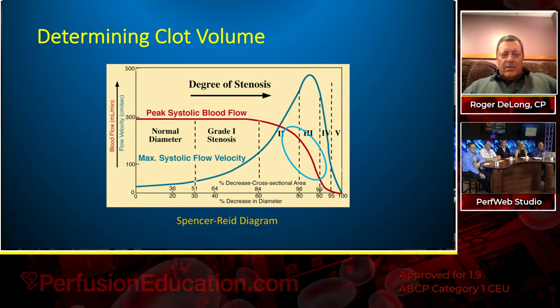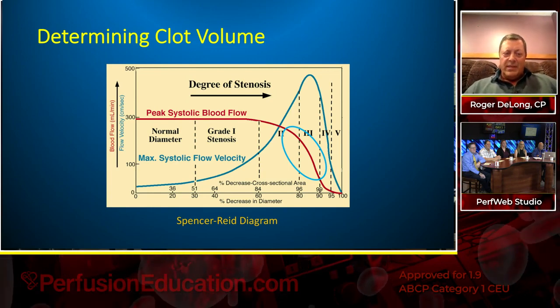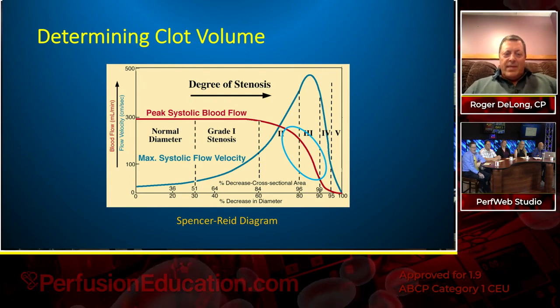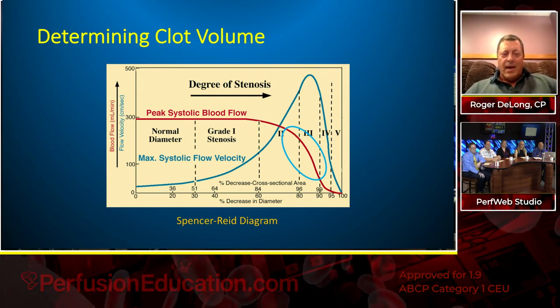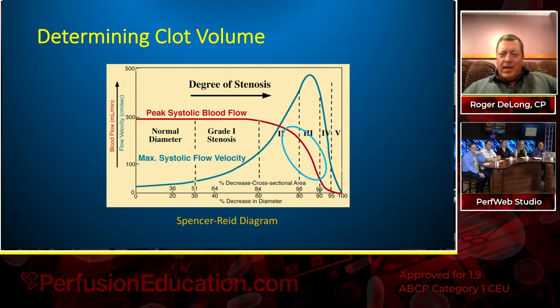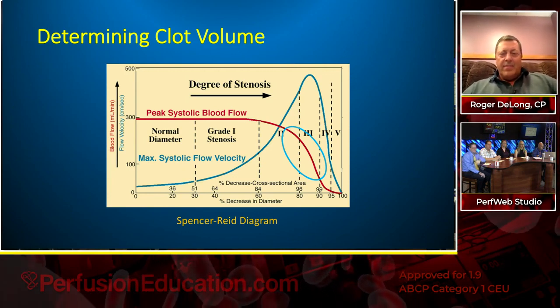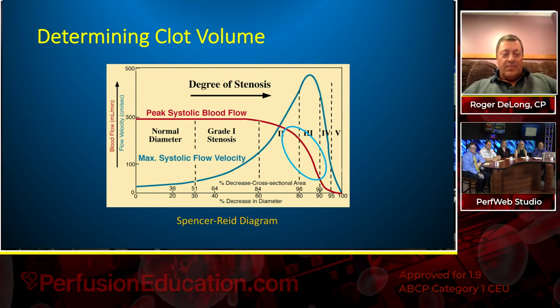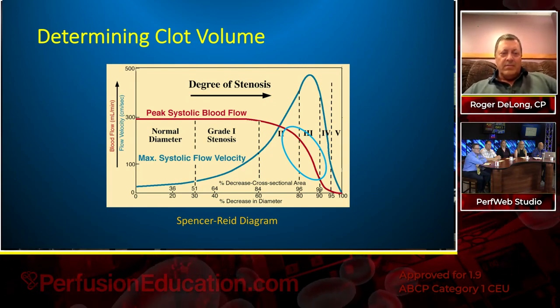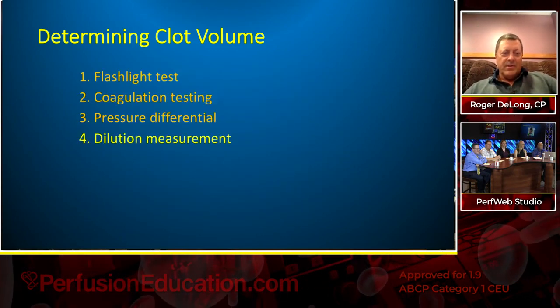This late end would also be inversely proportional to the occlusion you would see, the pressure you would see upstream from the oxygenator. So by the time you do see an upstream pressure rise, often you've got way too much clot to handle. The first time I was made to realize this by washing out oxygenators and looking at them, I was pretty taken aback. So my reaction was kind of the same as a lot of perfusionists when they see this. Next picture. Well, this got my attention. Yeah, it's about right.